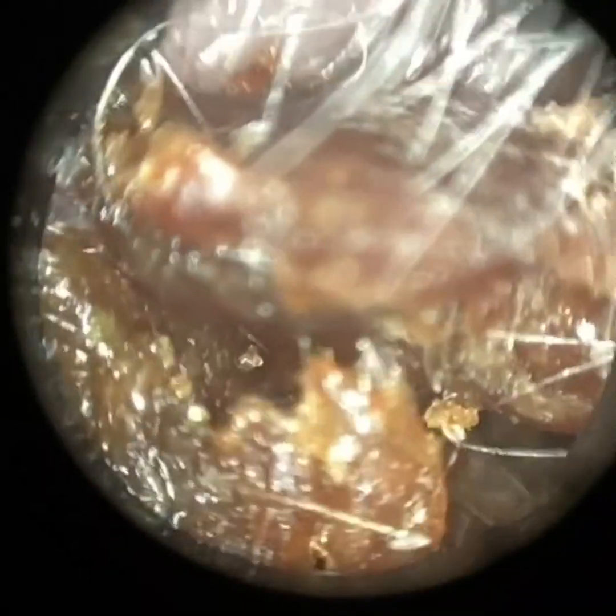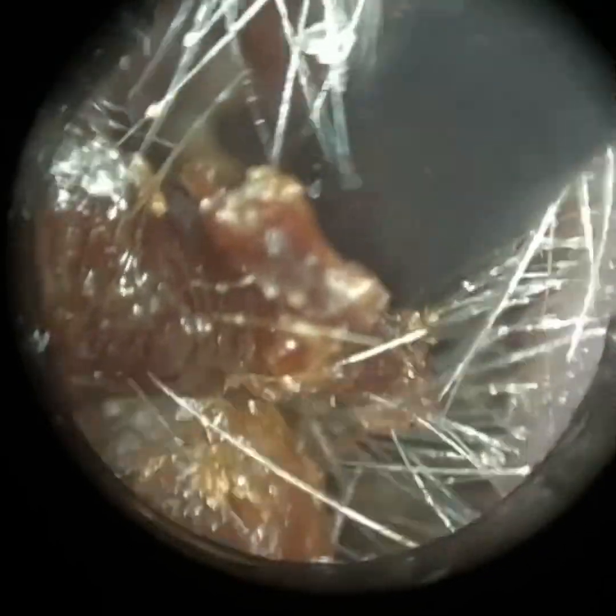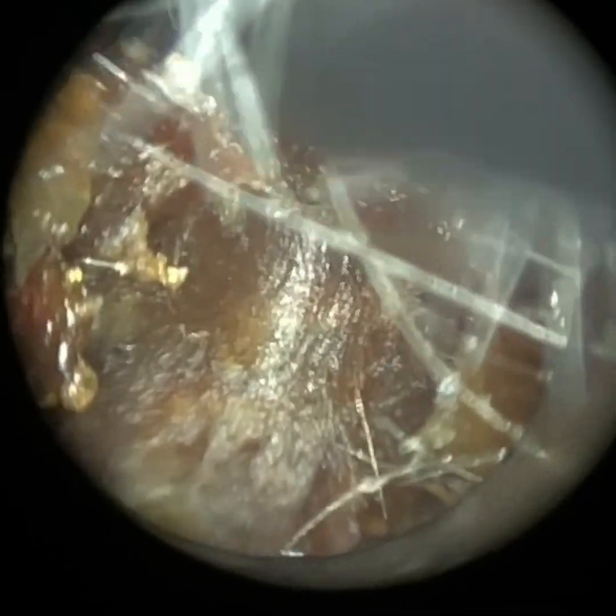We're just going to re-enter. Now I'm using our medium-sized specular, which has got an internal diameter of 4.25mm. But we do have a smaller one as well for paediatric or stenotic ears, which is a 3.5mm specular, and we've got two larger ones — a 5mm and a 5.75mm. I've managed to remove the wax laterally, and now going with the angled corette — there's an opening at the top, so I'm just gliding the corette over and beyond. You can now begin to see that this plug is extending all the way into the deeper regions of the ear canal.